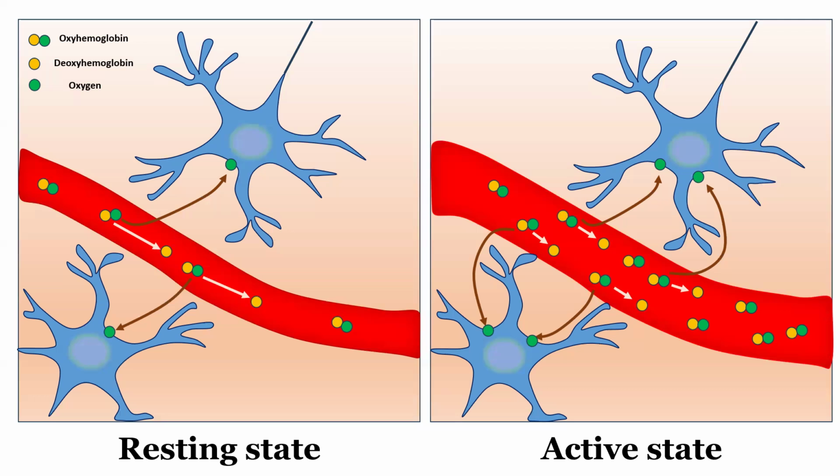So, despite the fact that neurons are using more oxygen and taking up more oxygen at this moment, because of the increased blood flow, the level of oxyhemoglobin will be higher than that of deoxyhemoglobin. So you would expect it the other way around. If neurons are more active, we would expect to see more deoxyhemoglobin in the blood. But no, something else happens: blood flow increases and the body supplies the brain in that particular area with more oxygen-rich blood that it really needs.